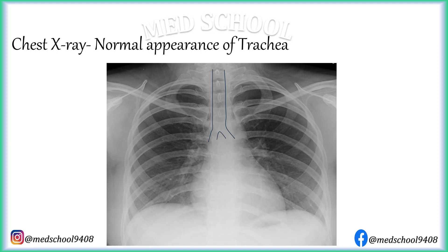Trachea is visible as a radiolucent structure just behind the spinous processes. It is midline in position, but sometimes with slight deviation to the right. Trachea can be pulled to the same side by pathologies like fibrosis or collapse, or pushed to the opposite side in pathologies like pleural effusion or pneumothorax. Luminal narrowing in the trachea or a foreign body in the trachea can be appreciated on chest X-ray.